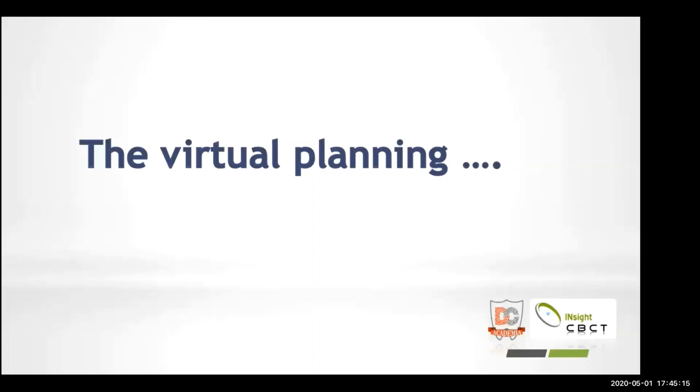So as we just saw, Dr. Swapnil, in the Exoplan software, integrated the CBCT scan and the intraoral scan, both in the digital format. These two scans were merged and then he did the virtual planning. Now, just as a disclaimer, this was not the perfect virtual planning, but a mere overview for you to understand the process. The actual process does not happen in 10 minutes like that.